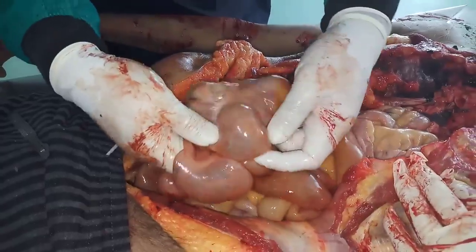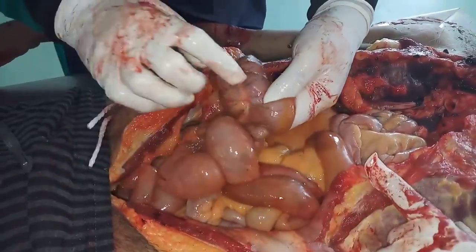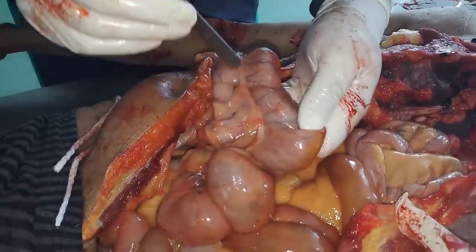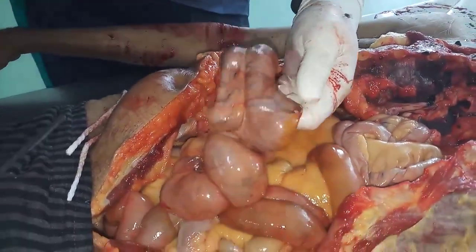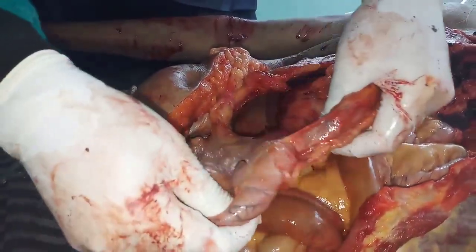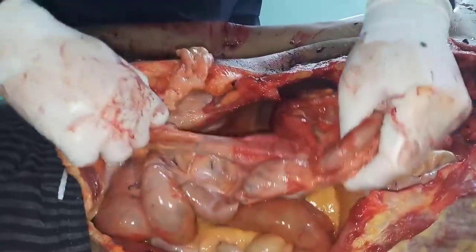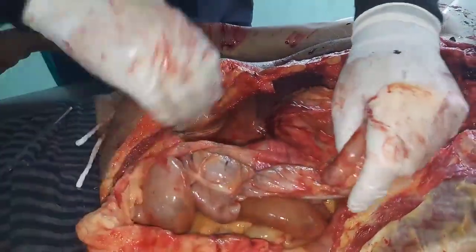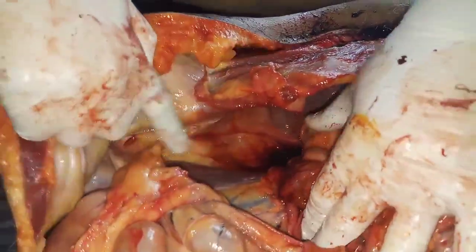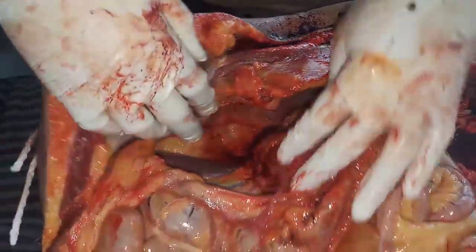So this is the large intestine. You can see these are called taenia coli on the surface. This longitudinal band of muscle is called taenia coli, and you can see the haustrations in the large intestine, which are not there in the small intestine. And below you can see these muscles, the muscles are there. You can see. So we'll close it from here.